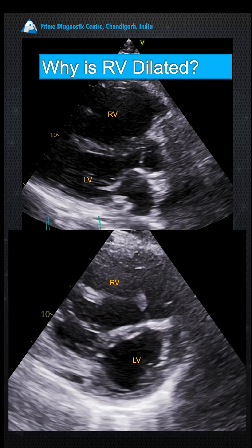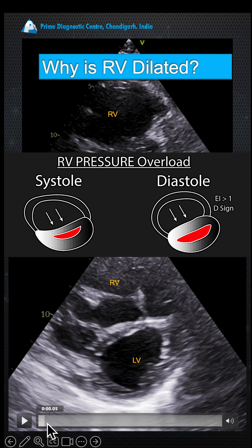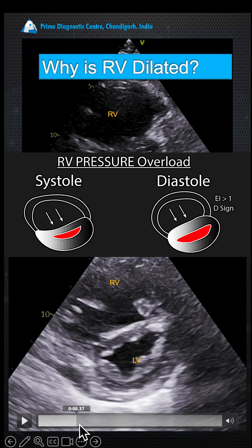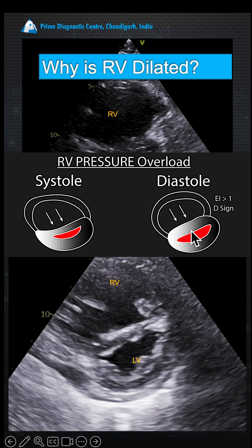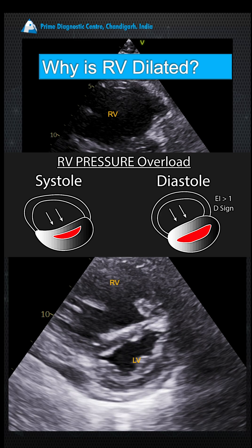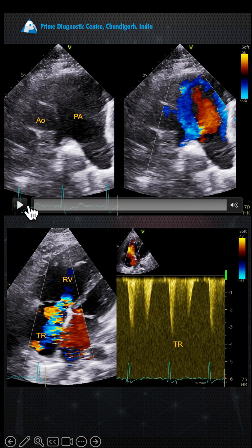Another patient with RV dilatation — again, follow the same rule. This time the D does not form in diastole; it's a full circle in diastole, and then the D forms in systole. A D-shape in systole means RV pressure is equal to or greater than LV pressure, which indicates pulmonary artery hypertension and pressure overload.